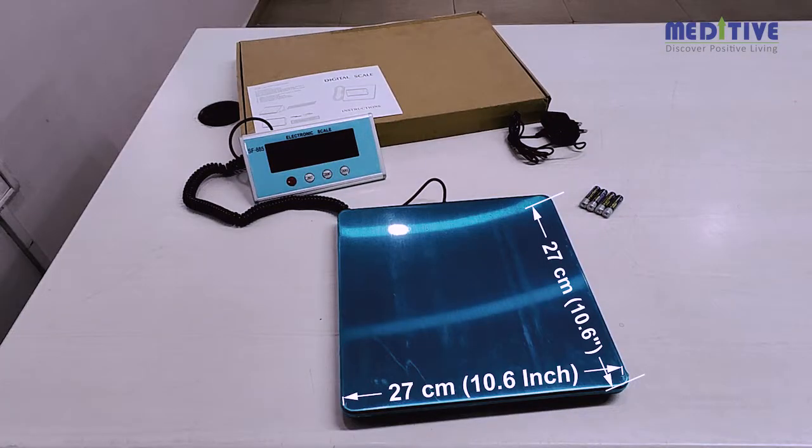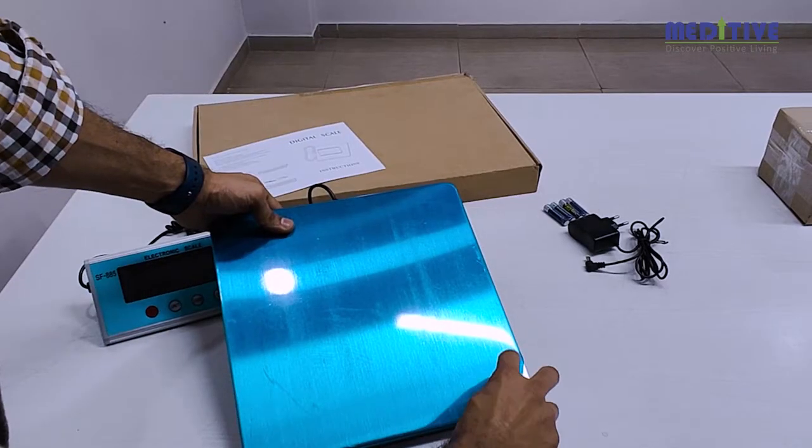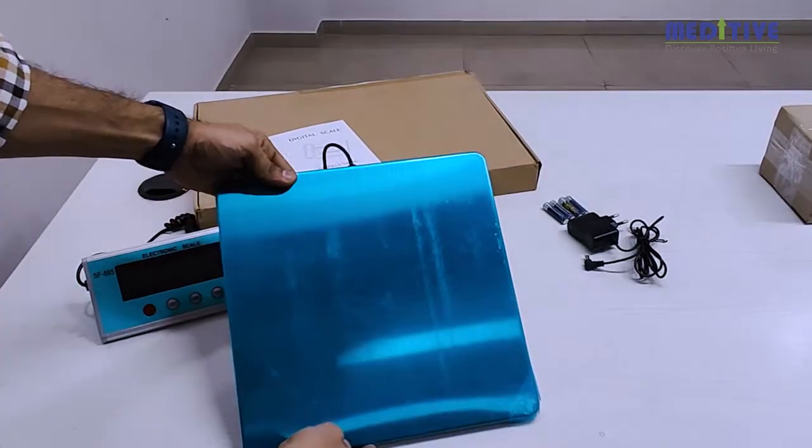The platform is made of stainless steel and the size of the platform is 10 inches by 10 inches. There is a thin film on top of the platform to protect it from scratches.